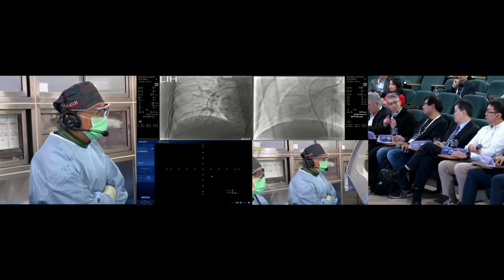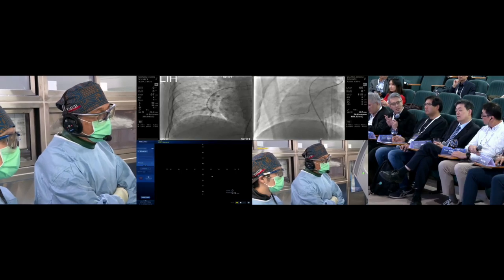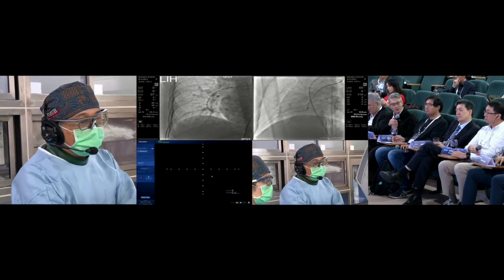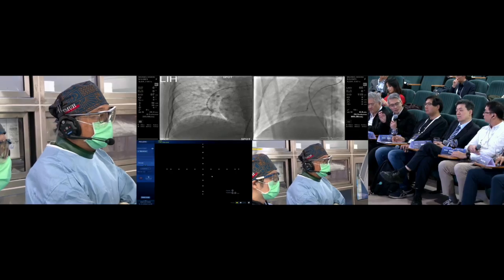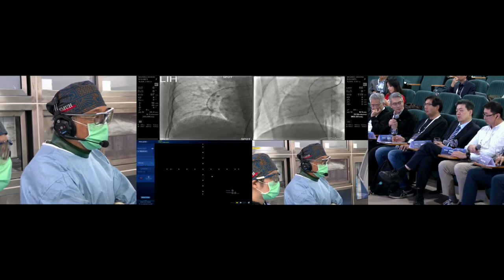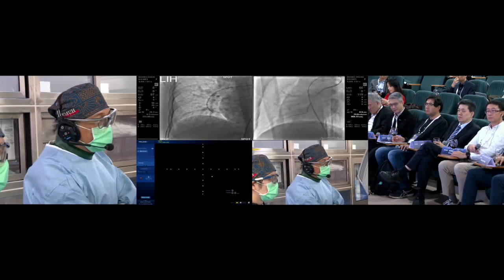I think it also depends on the etiology of the hemoptysis. A lot of the time it is wire injury. That's true. If it's a wire injury, then most of the time it can be treated conservatively. But with balloon perforation, it's a small vessel. If you use too large a balloon, then you will probably need balloon tamponade and even a covered stent to seal off the lesion. Yeah, sure.